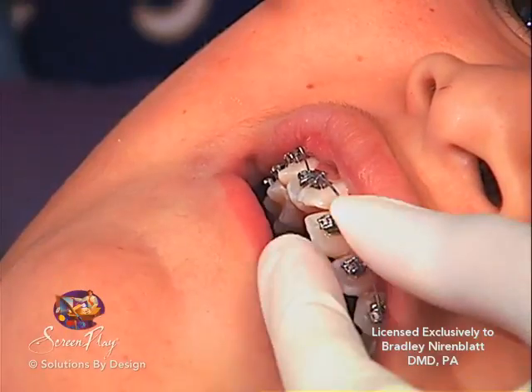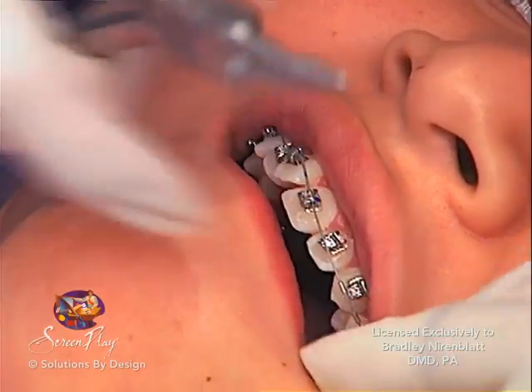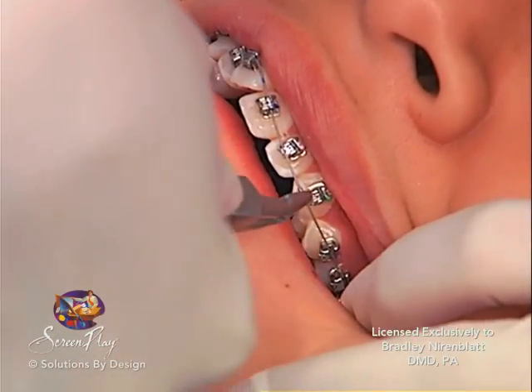Lastly, an arch wire is placed in the brackets and secured. Today's arch wires are made of special metal material that creates force to move the brackets as the wire tries to achieve a perfect arch. Your braces will go to work immediately.